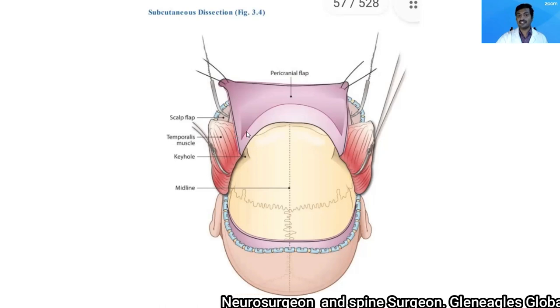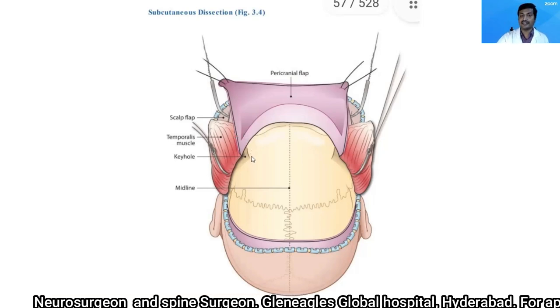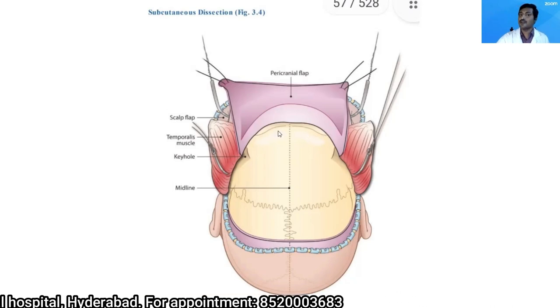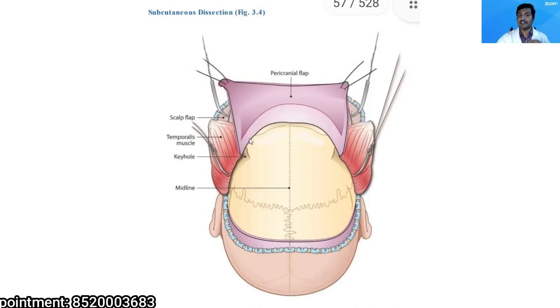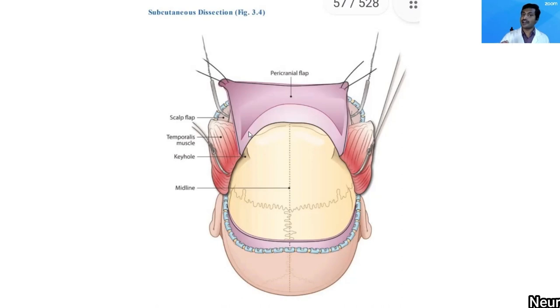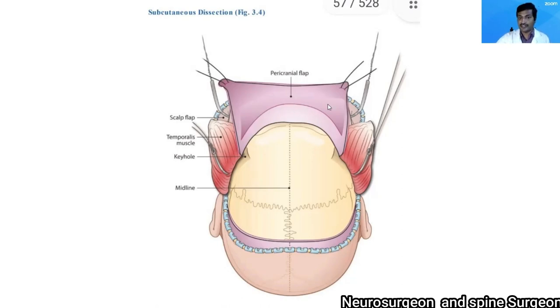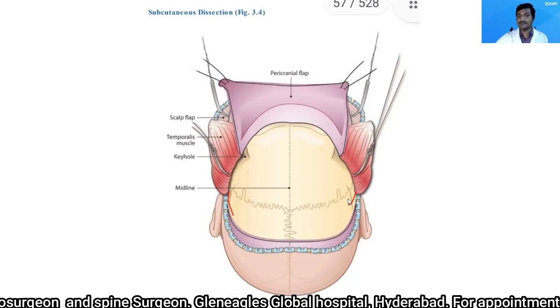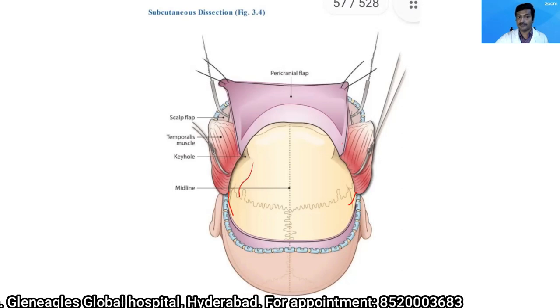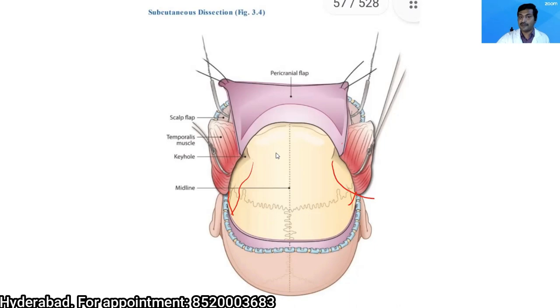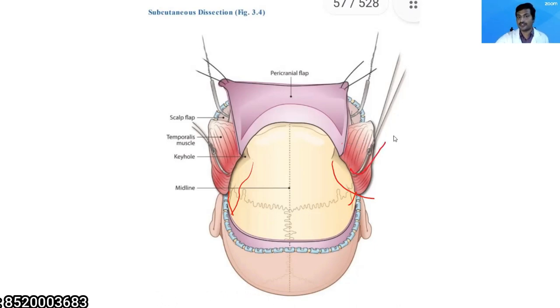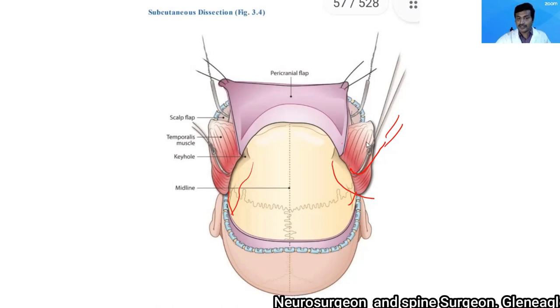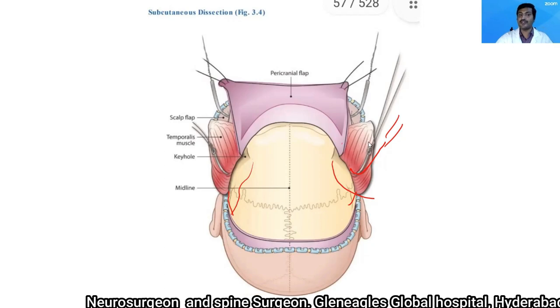Using a combination of periosteal elevator and blunt dissectors, I elevate the pericranial flap, taking every effort to keep it intact without holes — any small tear is sutured back. I cut the temporalis muscle at the posterior extent of the incision, detach it from the superior temporal line on either side, and reflect it anteroinferiorly with fish hooks. Gauze rolls are used under reflected flaps to prevent kinking of the blood supply.